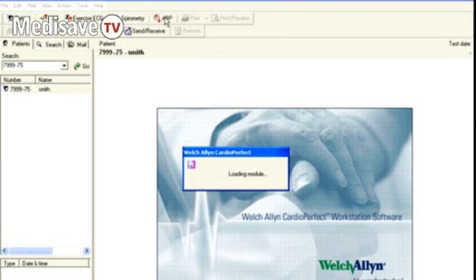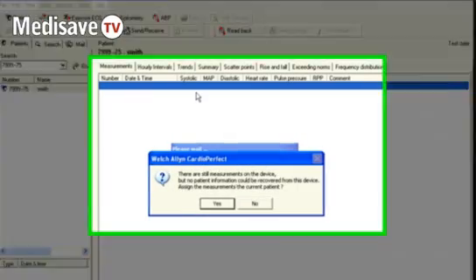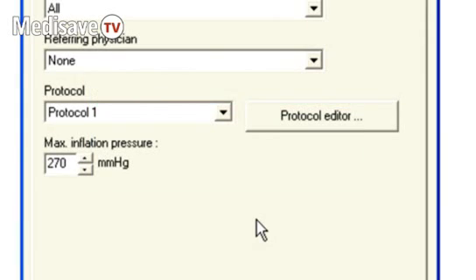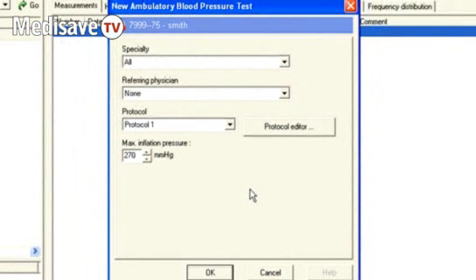Go up to the ABP icon and click on that. If there are measurements still on the device, you can assign those to the patient or delete them. Then it confirms the identity of the new patient.